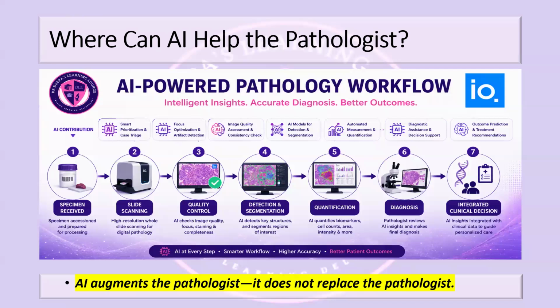Once the slide is digitized, the AI can perform quality control. In the sense, it can detect an out of focus image once the whole slide is already there with you. At the time that AI wasn't there and it was only digital pathology, each of these whole slide images used to be validated by the pathologist. You and I have to sit down and see, you haven't scanned this properly. Please clear the lens again and let's do it again. And the images are not coming too well, or the images are not getting zoomed out too well. The clarity is low. Please again go ahead and rescan it. These used to be the work of the pathologists who were adapting the digital pathology.